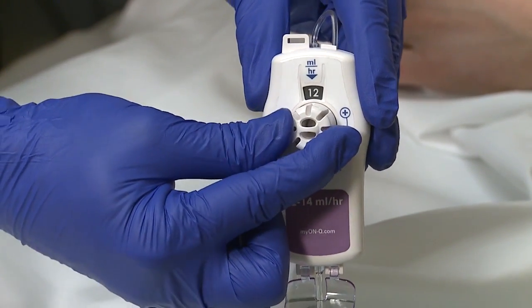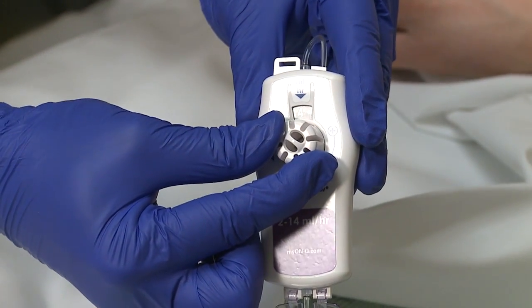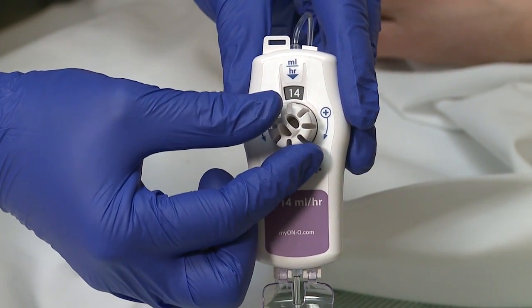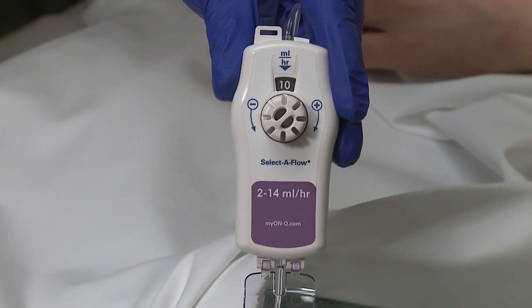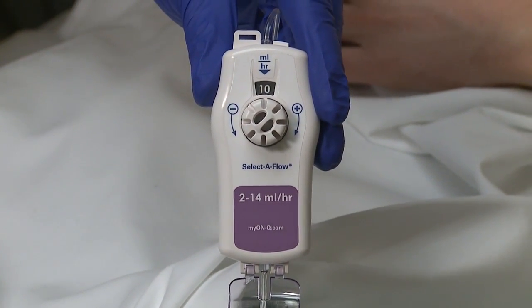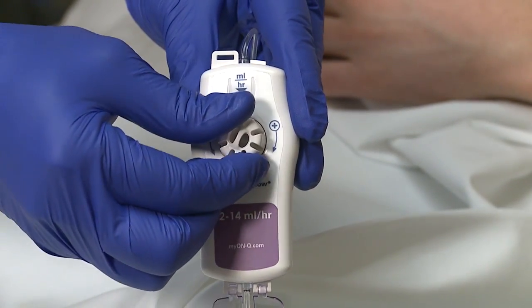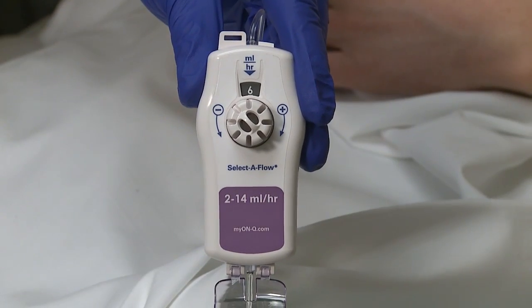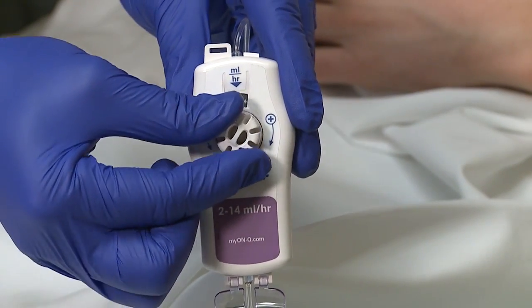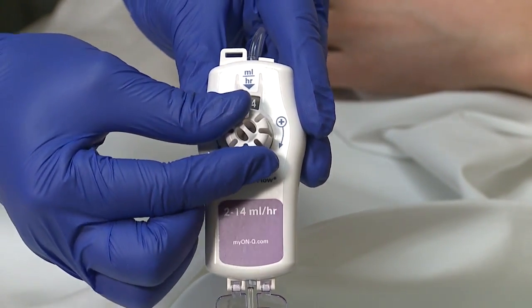To help you know what to expect, the balloon holds about 600 milliliters of local anesthetic. So if you keep the dial at 10 mils an hour and never change it and never use the squeeze button, it will last you 60 hours. If you keep it at 6 mils an hour, you could have nearly 5 days. But if you keep it at the max rate of 14 mils an hour, it would only last you less than 2 days.